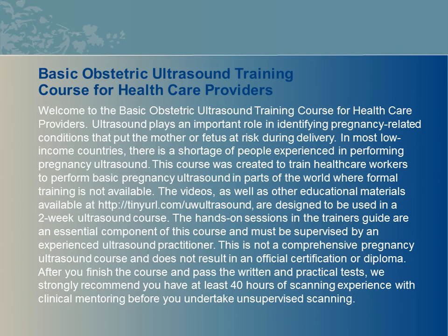Ultrasound plays an important role in identifying pregnancy-related conditions that put the mother or fetus at risk during delivery. In most low-income countries, there is a shortage of people experienced in performing pregnancy ultrasound. This course was created to train healthcare workers to perform basic pregnancy ultrasound in parts of the world where formal training is not available. The videos, as well as other educational materials available at tinyurl.com/UW ultrasound, are designed to be used in a 2-week ultrasound course.